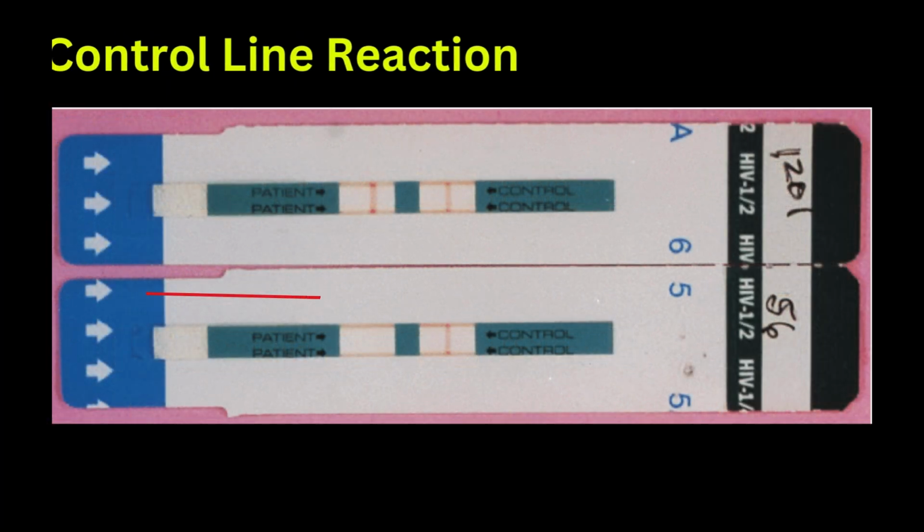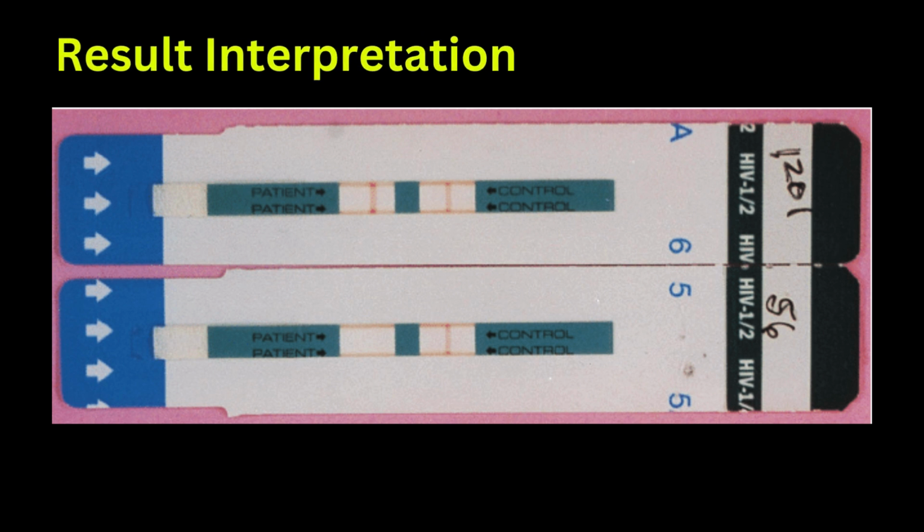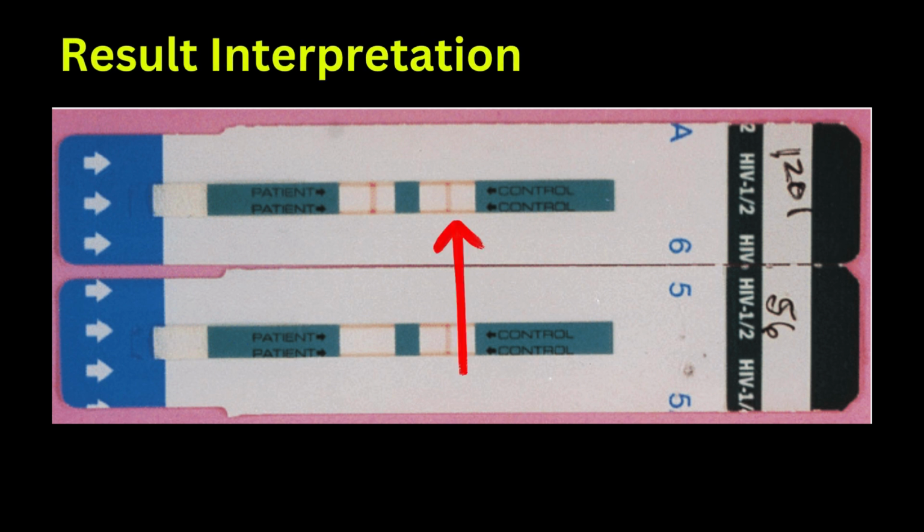5. Control line reaction. The sample then reaches the control line, which contains antibodies that bind to the labeled antigens regardless of the presence of HIV antibodies. This line appears in all valid tests, confirming that the test has worked properly. 6. Result interpretation. The presence or absence of colored lines at the test and control regions determines the result.